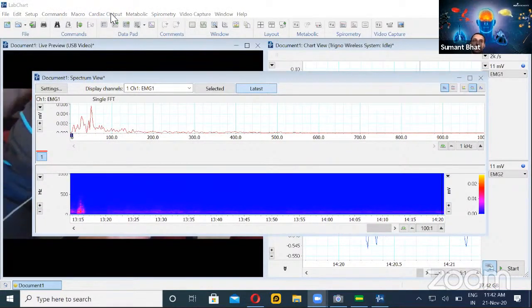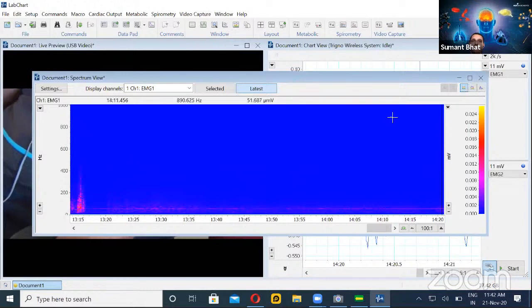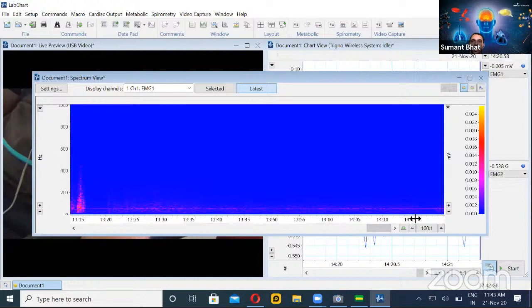There are two components here. The first shows the FFT in the complete spectrum with frequency components — it is a two-dimensional signal. The second is a three-dimensional spectrogram that can give you an idea of amplitude, time, and frequency all together. On the left you have frequency components at 0, 200, 400, 600 Hz and so on, and the horizontal axis is time.